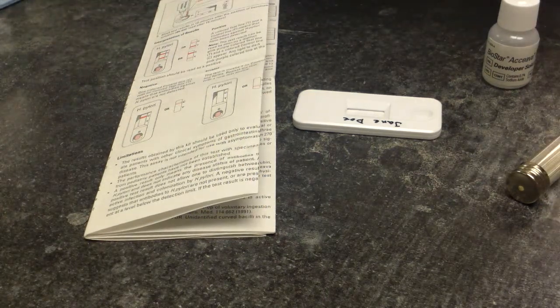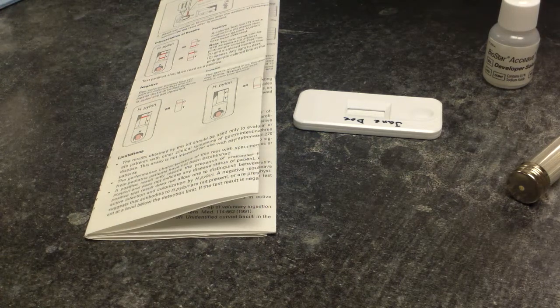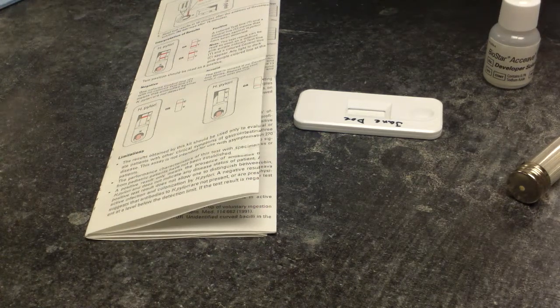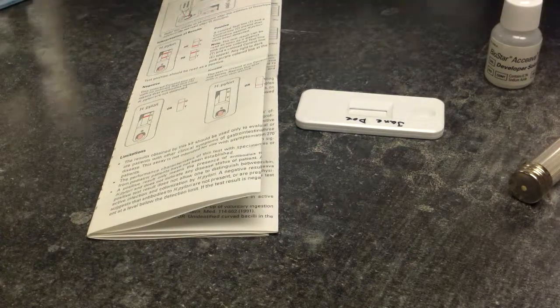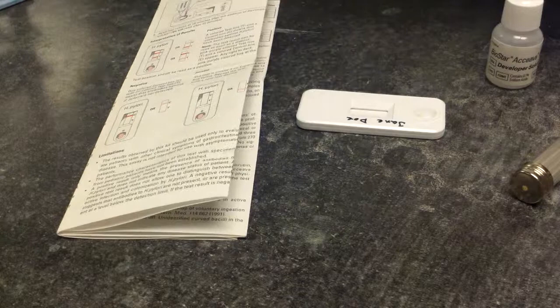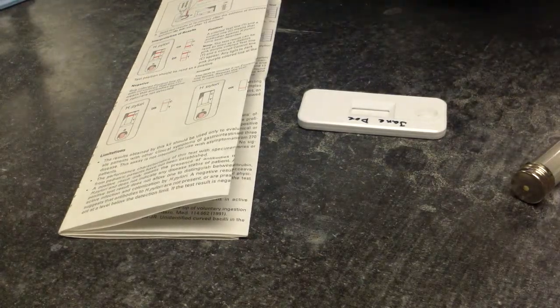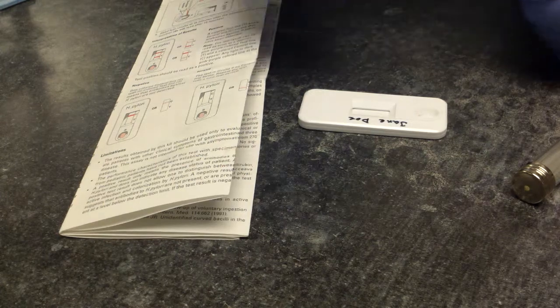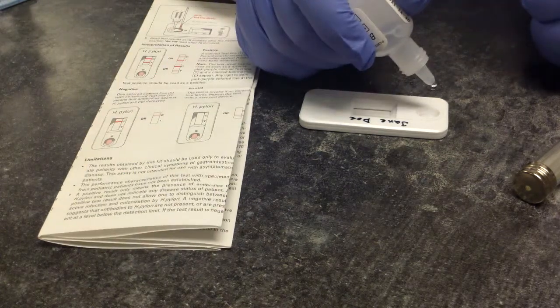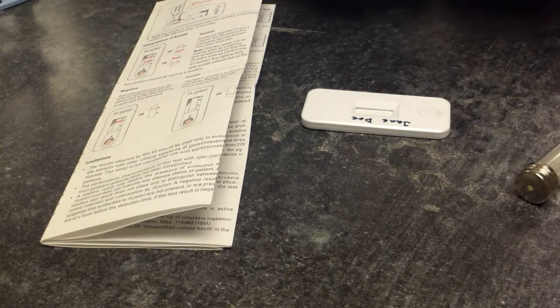So what I'm going to do is, because I'm using serum, I'm going to fill it to just the green line. I'm then going to apply the sample into the sample well, and I follow that with 2 drops of developer. The procedure for whole blood would be the same, except I would fill it to the red line.